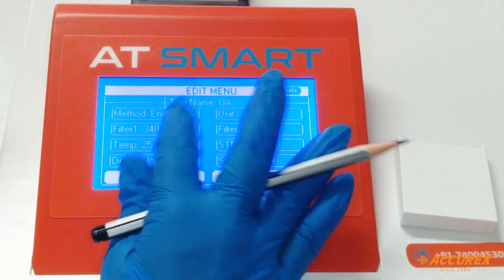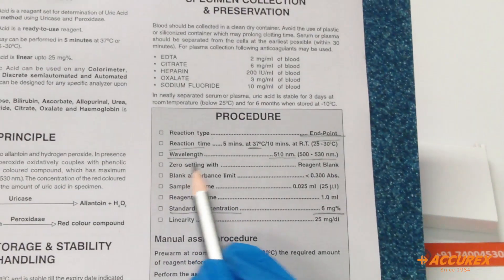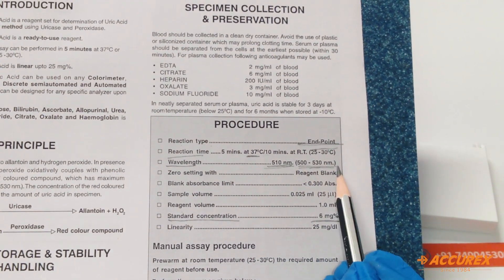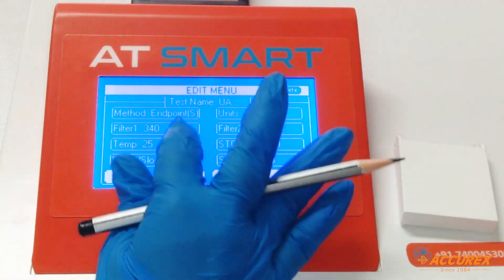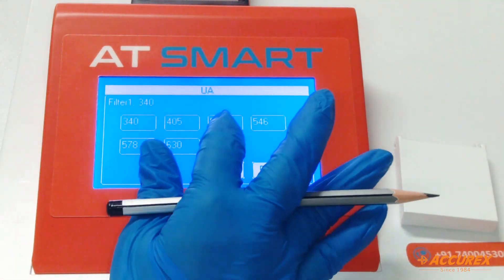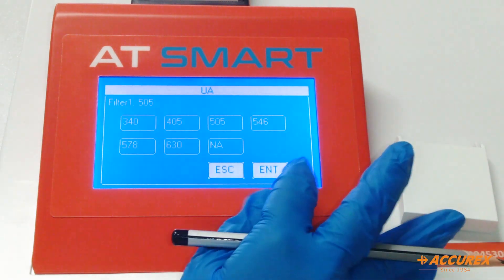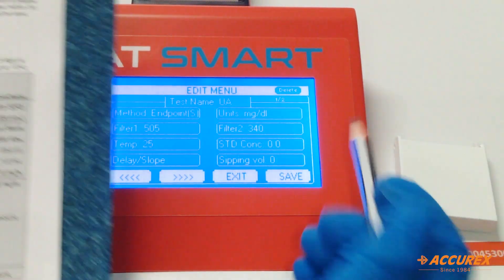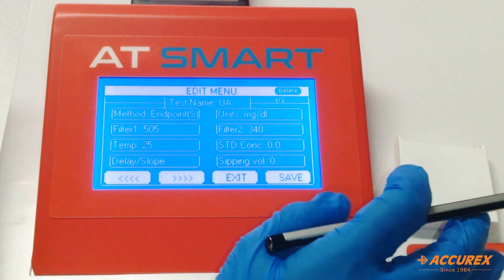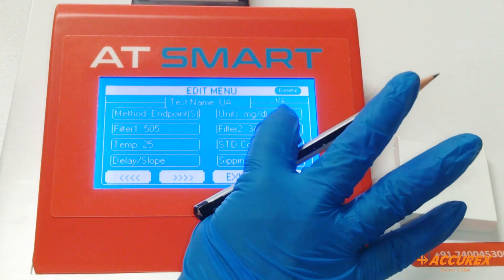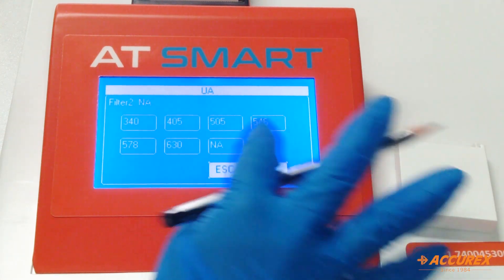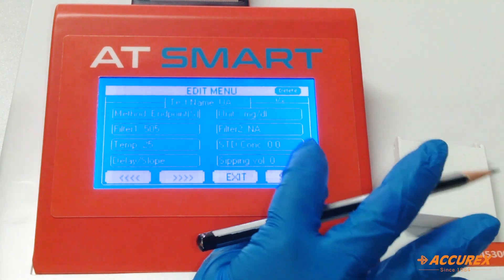The second parameter is filter. The wavelength is 510, that is 500 to 530 nanometers, so select 505 and enter. For Filter 2, because it is endpoint chemistry, Filter 2 is not applicable, so select NA and enter.